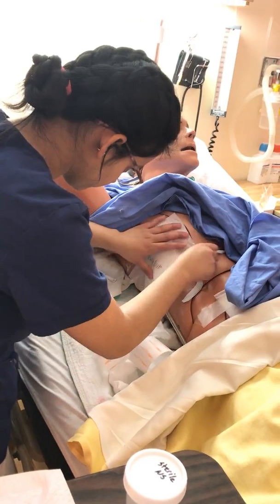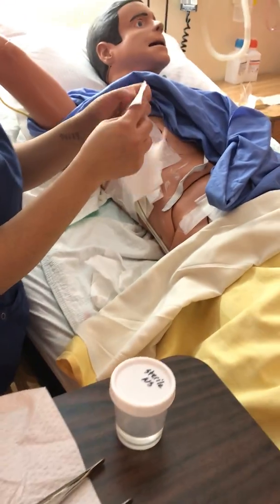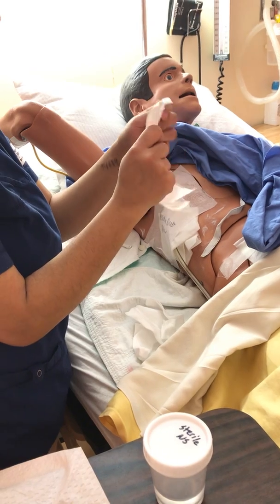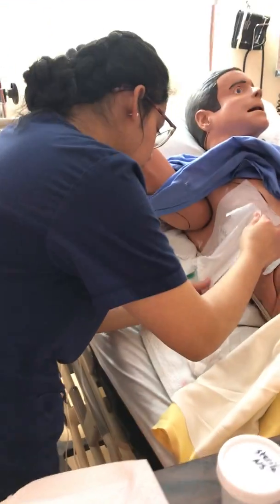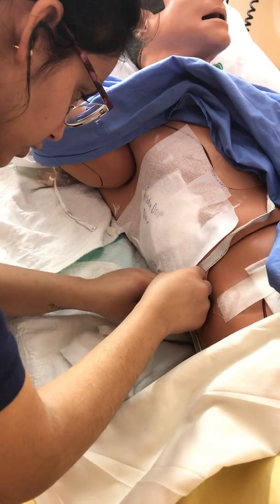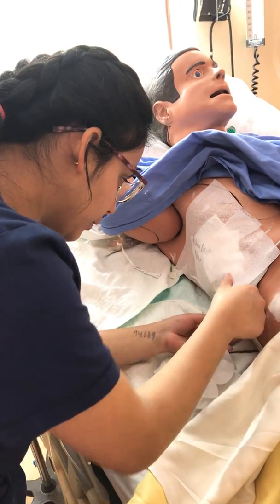So I'm going to get rid of the air bubbles in there. I'm just gonna put one more. Use my finger at the bottom. As long as I remain inside of the air, I'm just putting it all sterile. I'm just going to make sure I have 10 ml. So I have 10 ml right here, and there's no bubbles or anything. It's good. Now I'm going to put the mask on, and I've made my needle already. So the tent is done, so then my patient doesn't pull on the tubing.